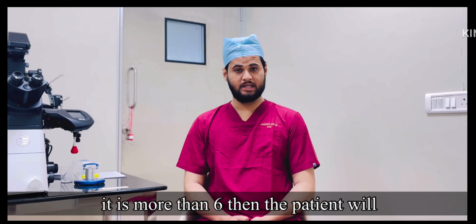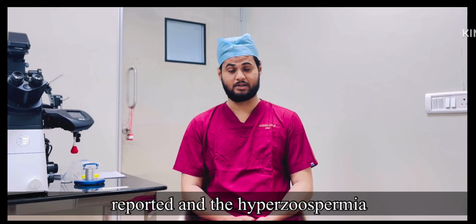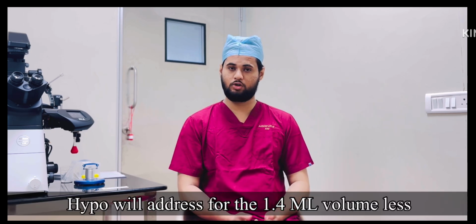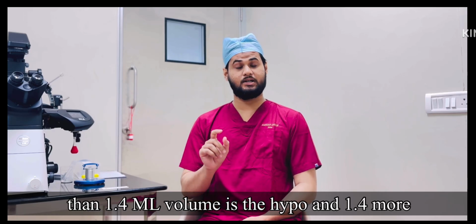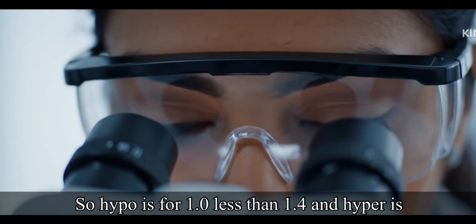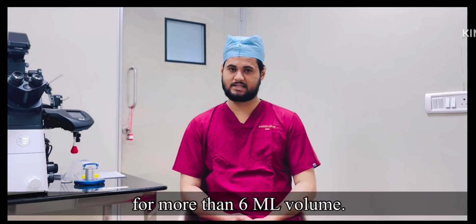If it is more than 6, then the patient will be reported as hyperspermia. So hypo is for less than 1.4 ml and hyper is for more than 6 ml volume.